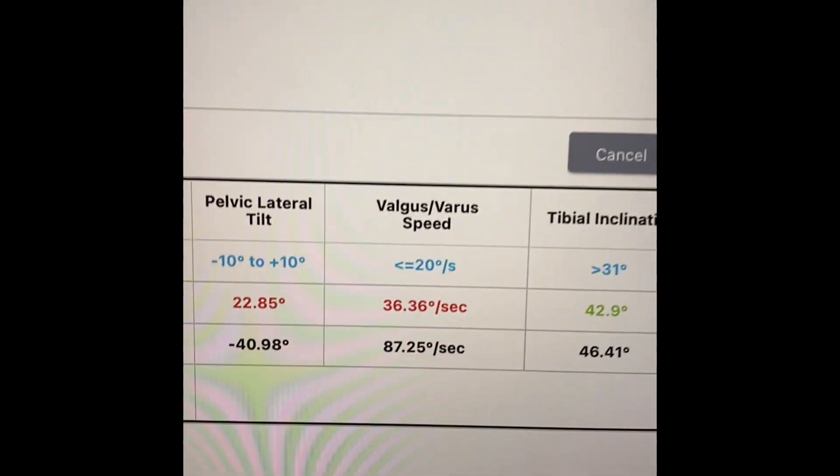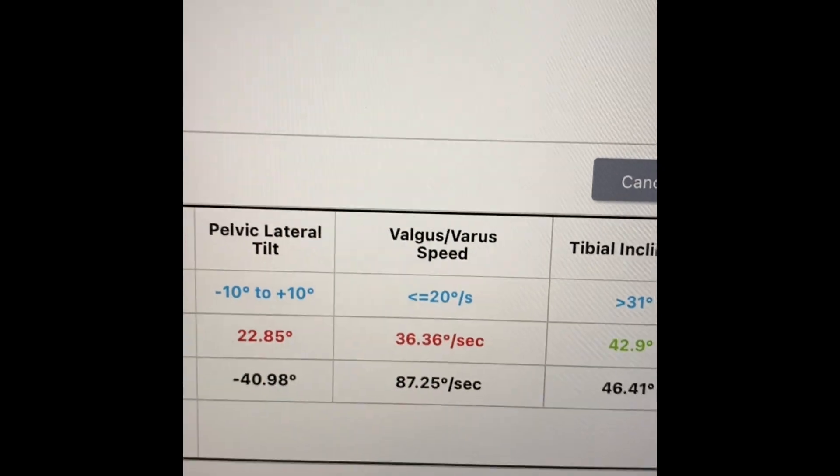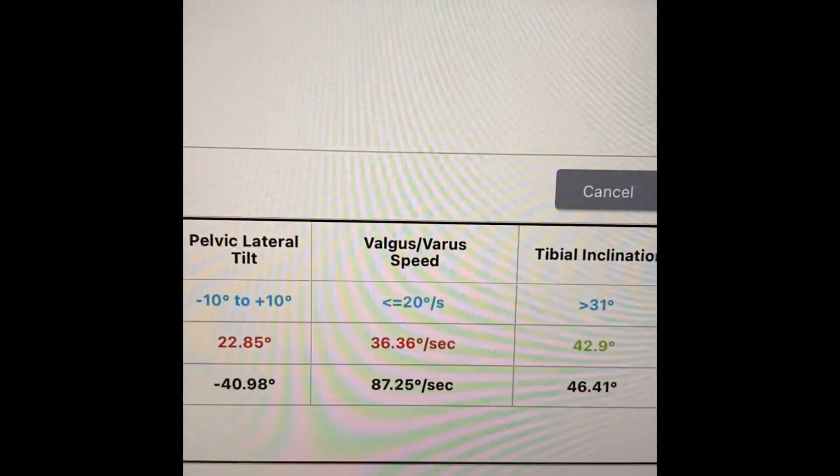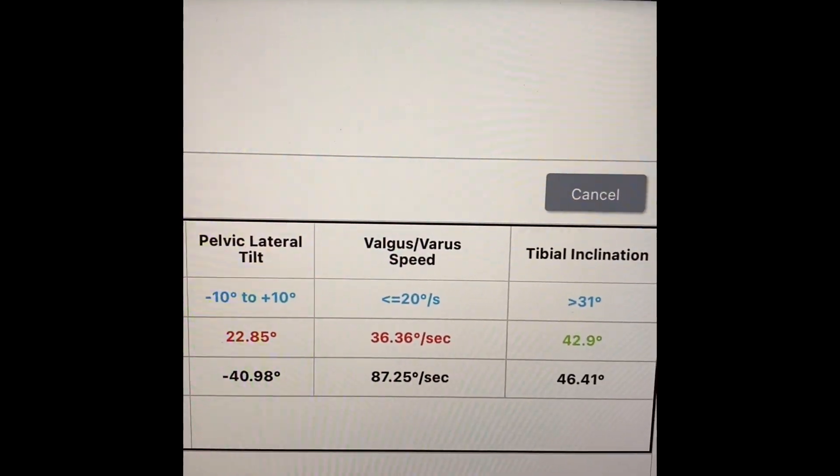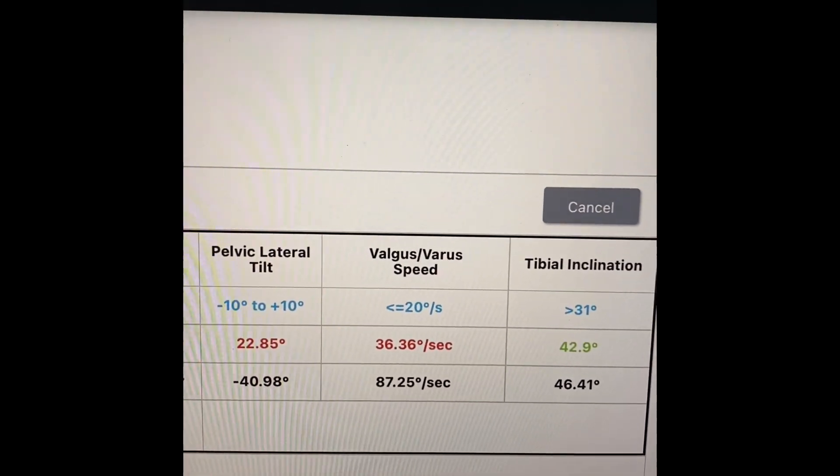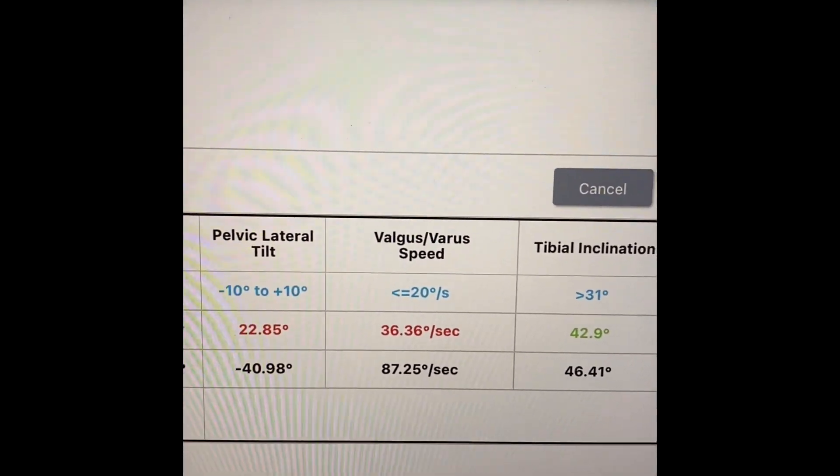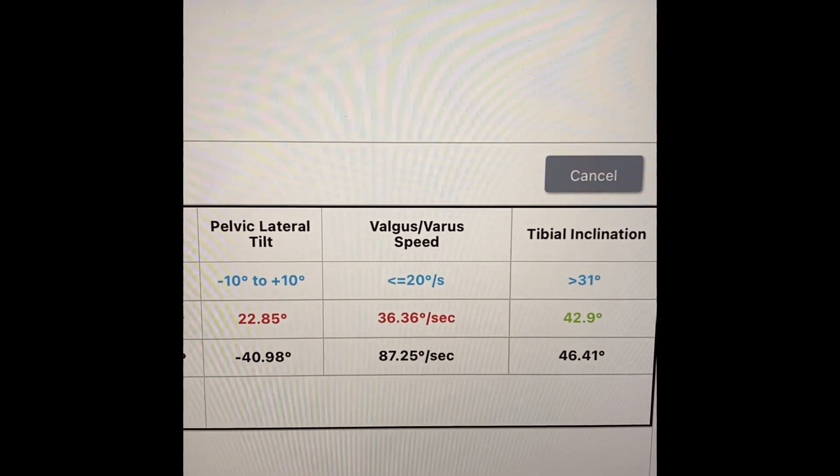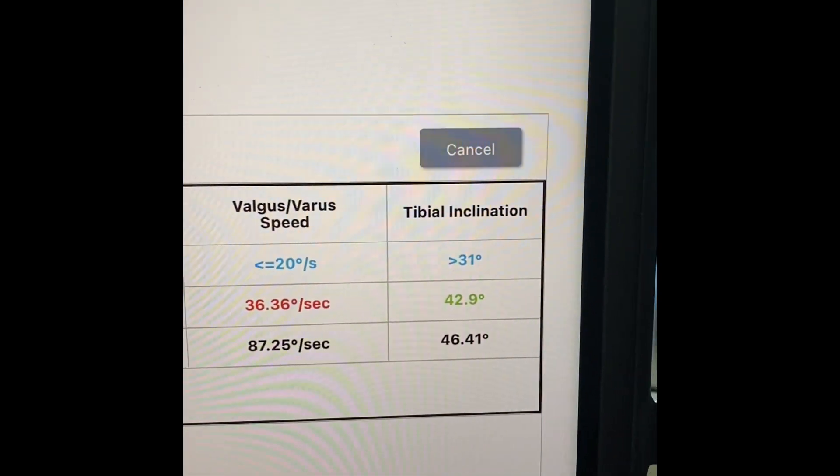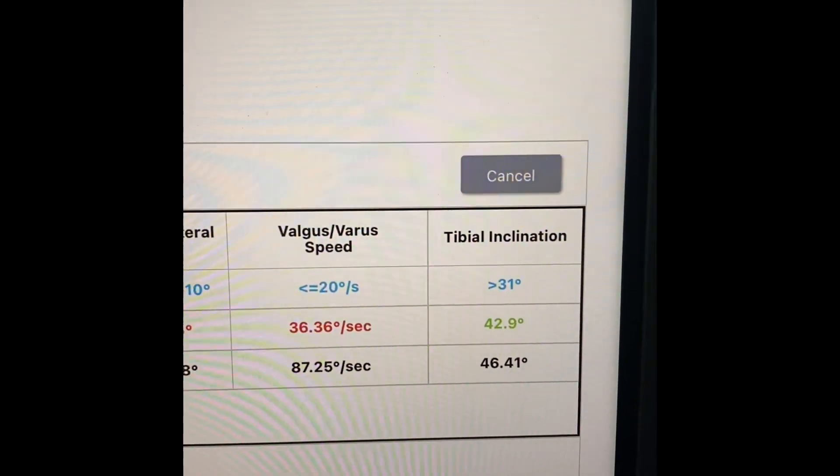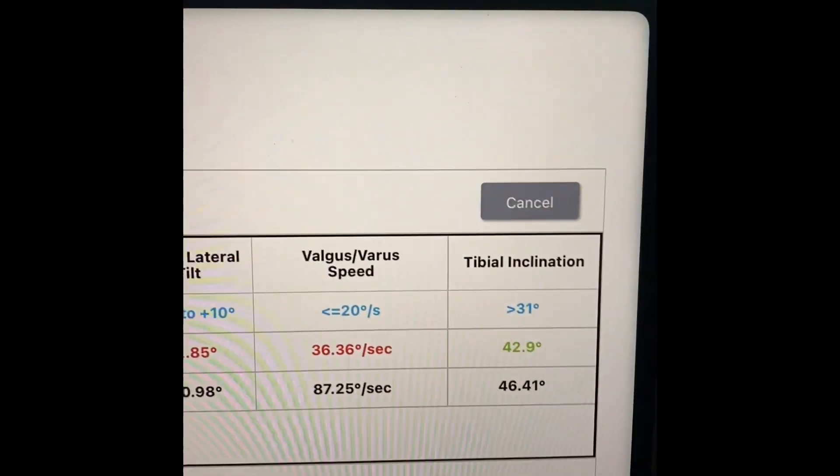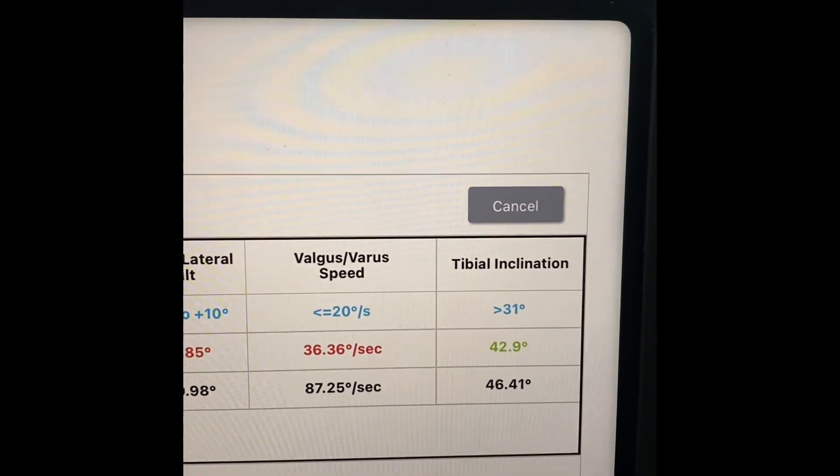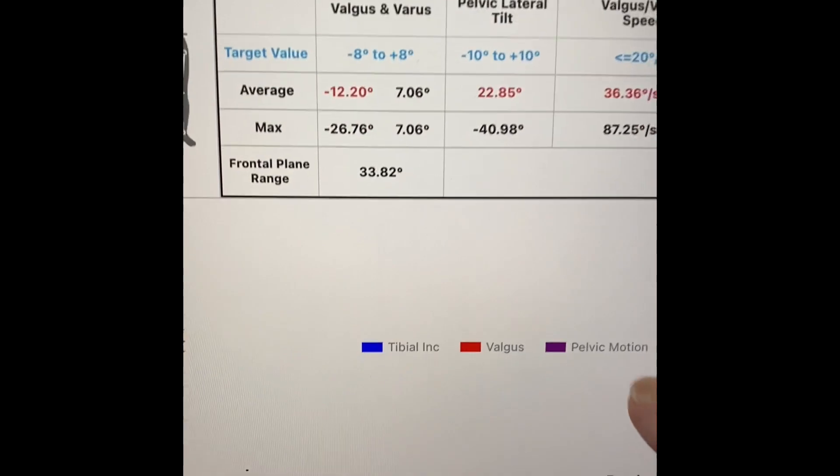Next thing that we see is speed of valgus. So we see speed of valgus based off of our normative data should be less than 20 degrees per second. And his average was 36 degrees. His max was 87 degrees. That final number, that tibial inclination, that's basically the depth of the squat. So we want that at 31 degrees or greater. And what we see is that he's well within that range.